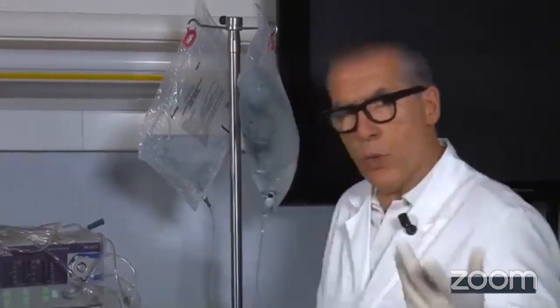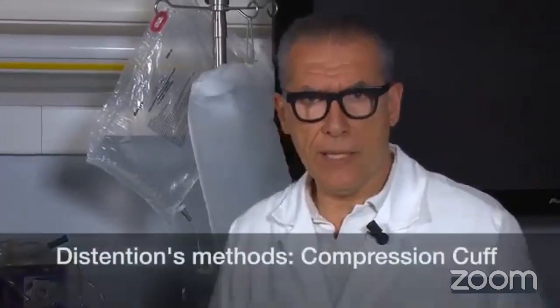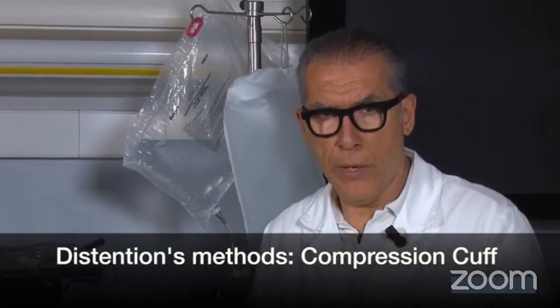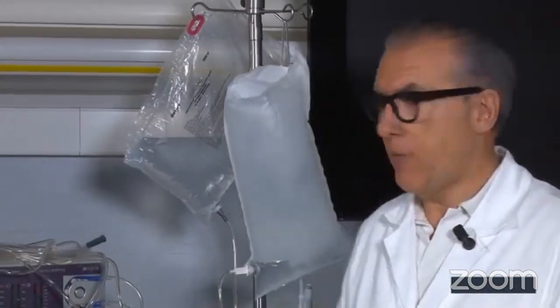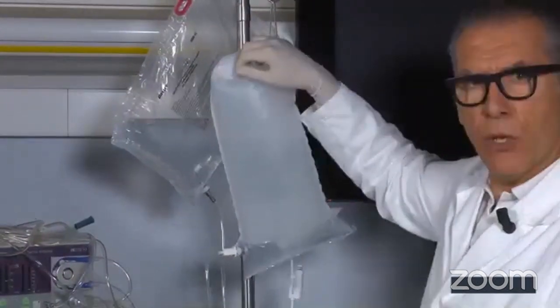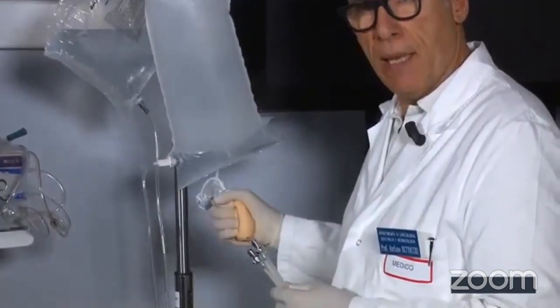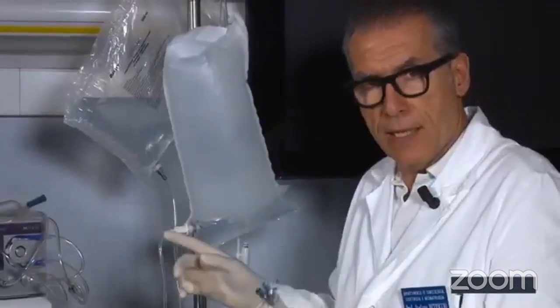Now we move to a different idea, not anymore the gravity pressure, but the compressive cuff. Now I have prepared for you a different example. So we are moving from the gravity pressure to another very well-known method for inflating liquid inside the uterine cavity. That is the compressive cuff. A compressive cuff is a sac with a membrane where you put inside your liquid sac and then you compress, pumping air inside the membrane here. So this will physically compress the sac.